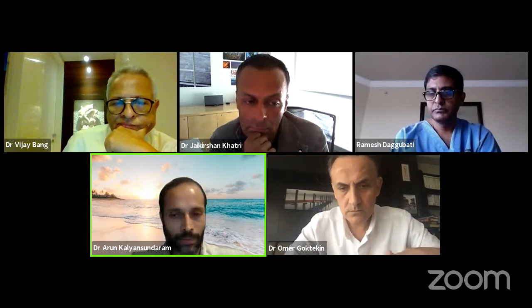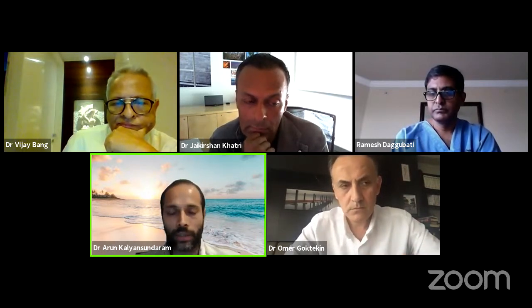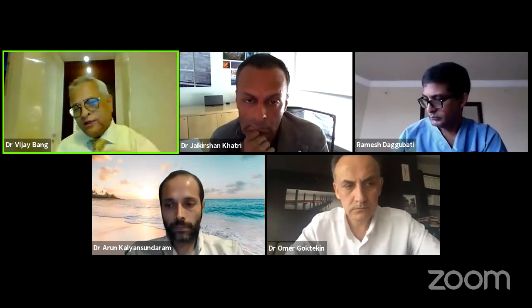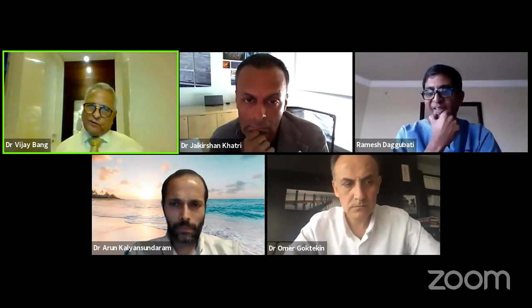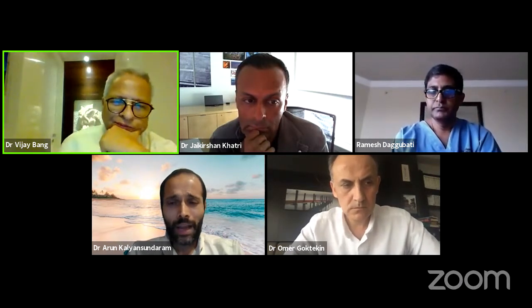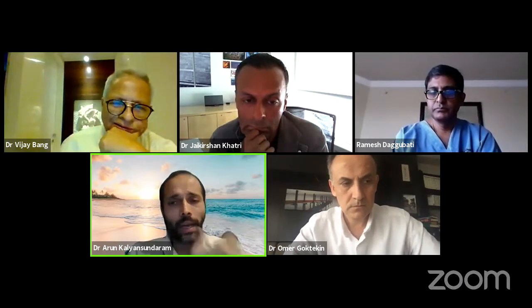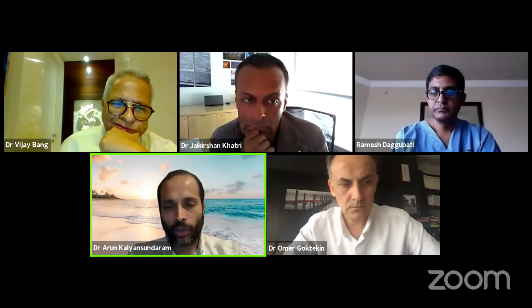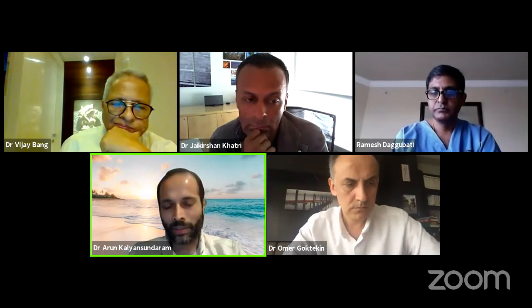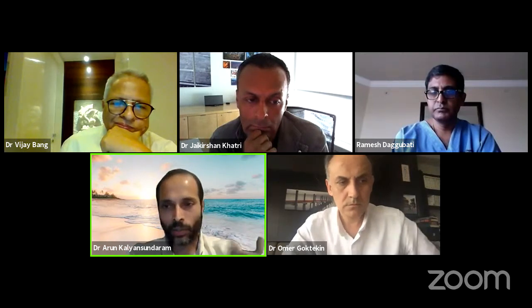And sometimes despite our best efforts, it doesn't work. And you have to have an option B or C. Yeah. Do you abandon if the hematoma is big, or proceed with another approach if the feasibility is there? Again, it really depends on your comfort level. Sometimes, it's a no-go, but there are times where you have a hematoma and you lose visualization, but you can still do a blind double stick and swap.